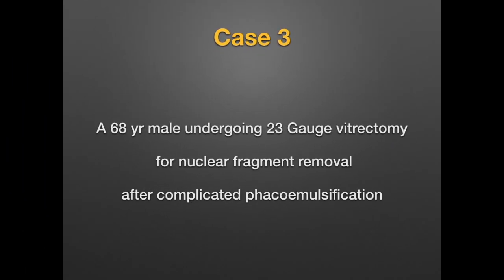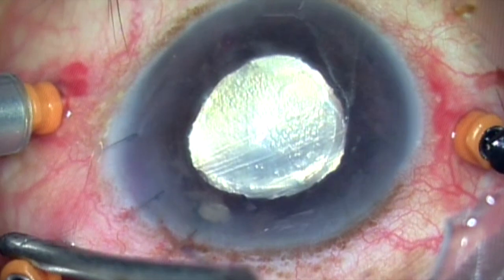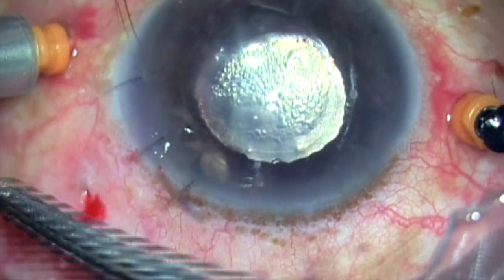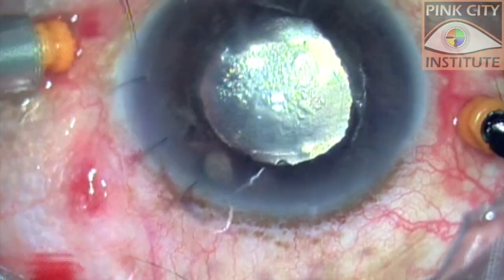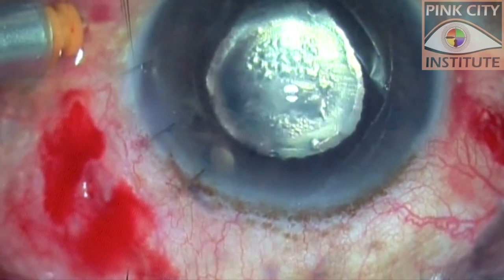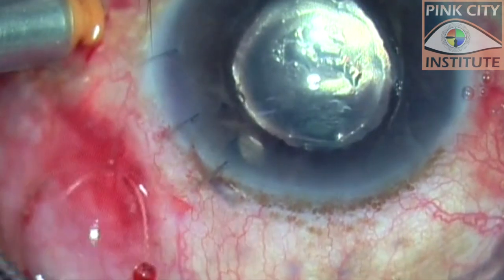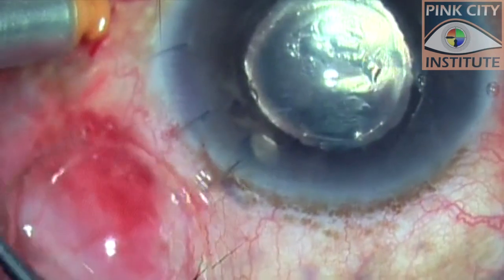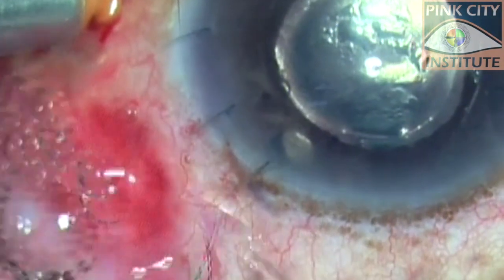Our third case was a 68-year-old male patient on whom 23-gauge vitrectomy was performed with base shaving for dropped nuclear fragments during previous phacoemulsification. Fluid-air exchange did not allow sealing of the superotemporal sclerotomy, and it was decided to suture it.